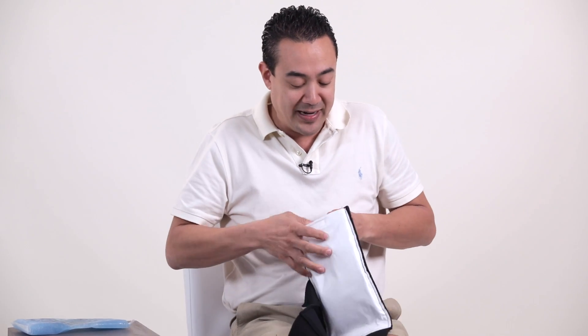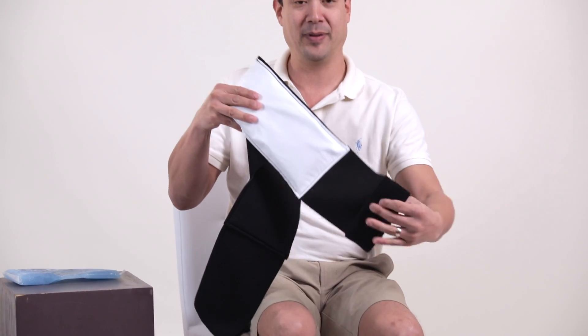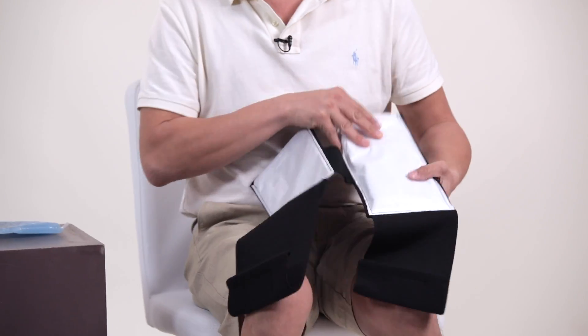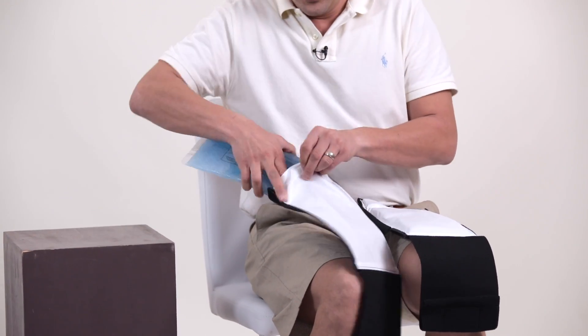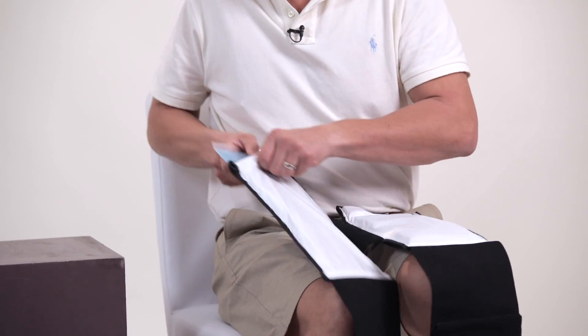One thing I do to make things a little easier is I'll take the hook and fold it back up on the back of the strap, so it doesn't get stuck to other areas of the pouch while we're preparing it. It just makes things a little bit easier. And get that other gel bag in there.